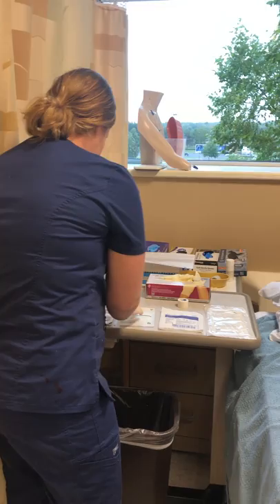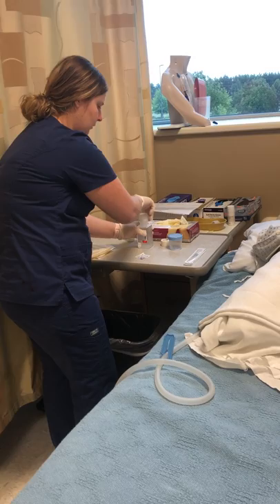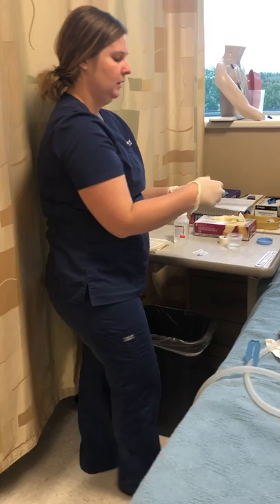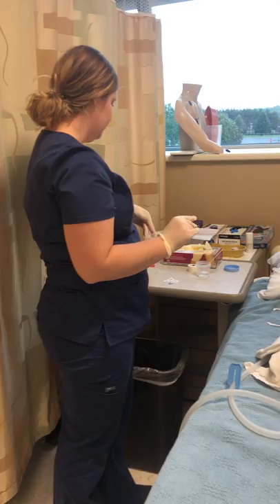Alright, for this part I'm going to need this, and I'm going to open my sterile water here. I'm going to open my sterile container and pour some in there, cover back on, and then using clean technique, I'm going to take my cotton swabs out and put them right in there. I'm all set.